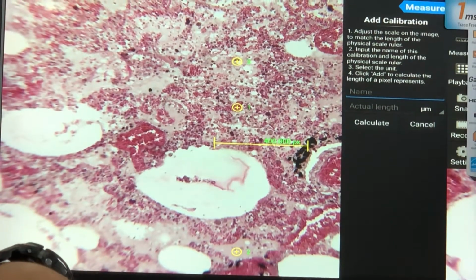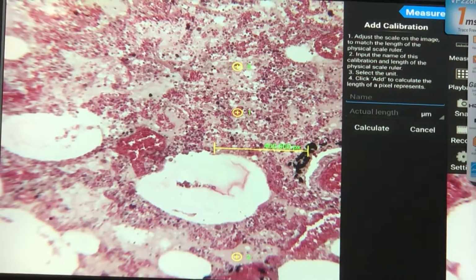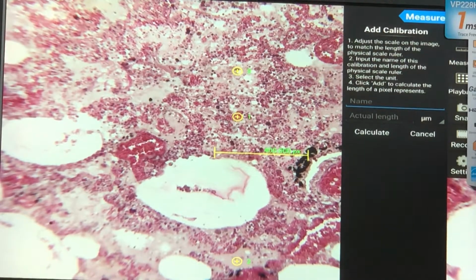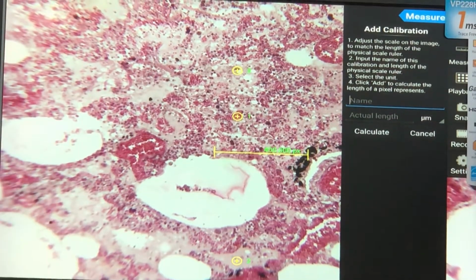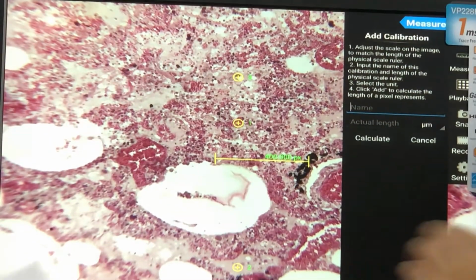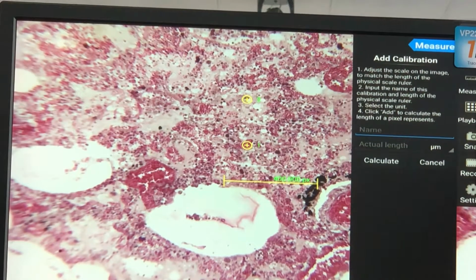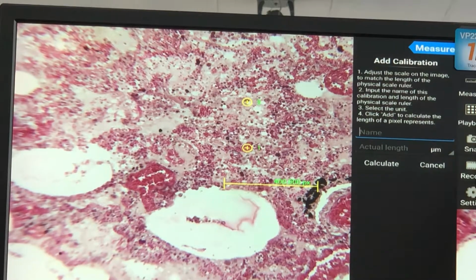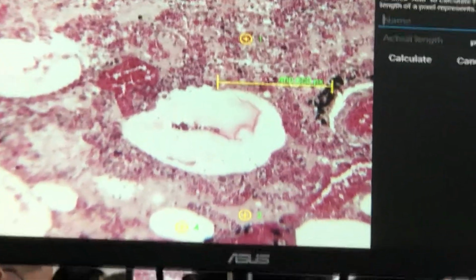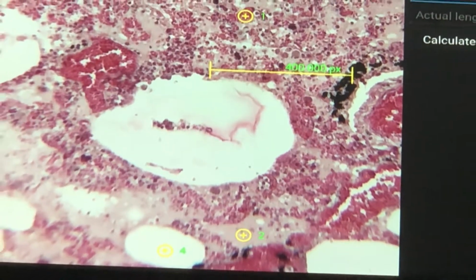And you will see peripheral features like thickening of the alveolar septa. Thickening of the alveolar septa actually is not shown here because the septa are big, so you can no longer see it. So these 3, picture this one, make your diagnosis of chronic passive congestion. Why is it the lungs? This is the lung tissue, the alveoli are empty space. However, those areas without the empty space are the congested part.